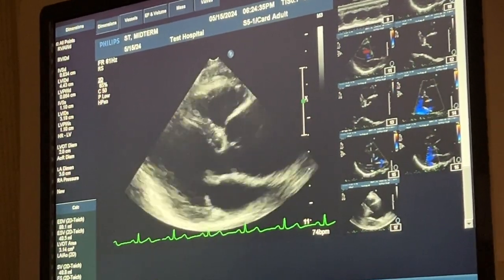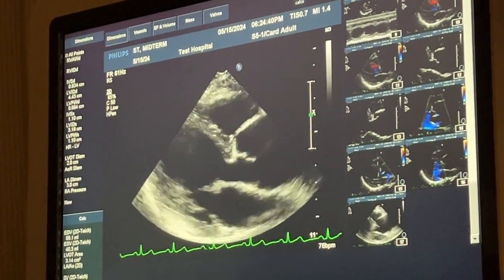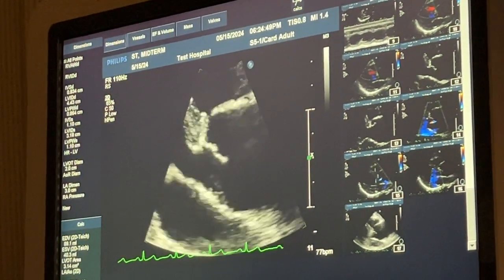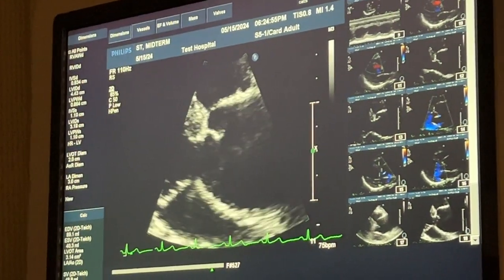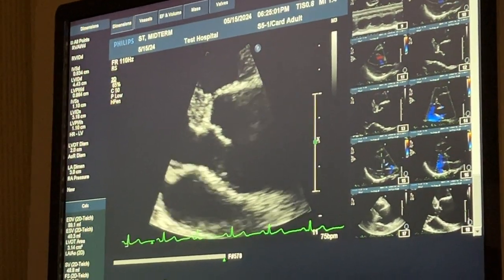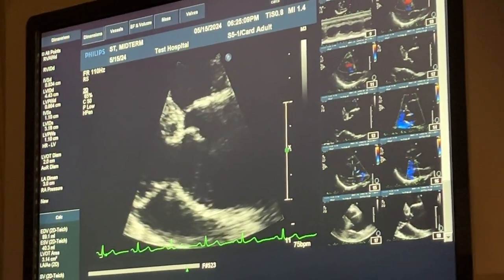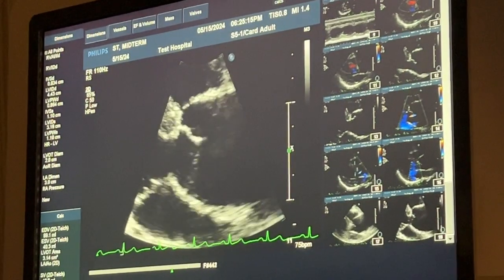But yeah, let's measure the root. I like the root from the standard view better. I can trust that it's on axis and measurable. So I had to zoom back in. Moving picture. Will you ever do the LVOT and the root in the same image? Not the same image because we would actually measure the root at end diastole. Why end diastole? That's its largest dimension. Because there's blood that's sitting there, just kind of chilling and filling.